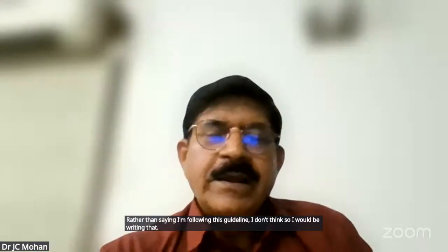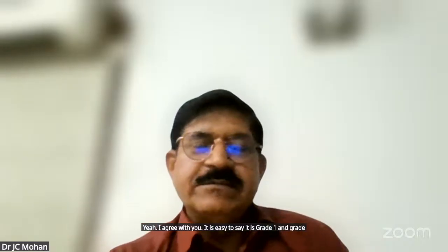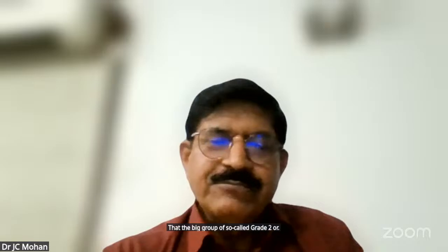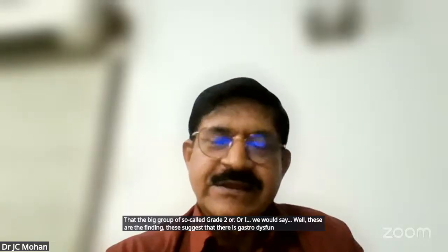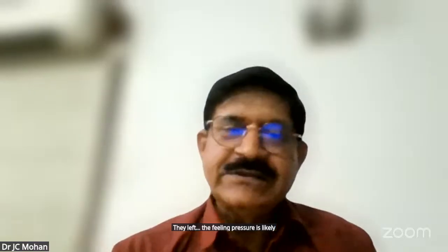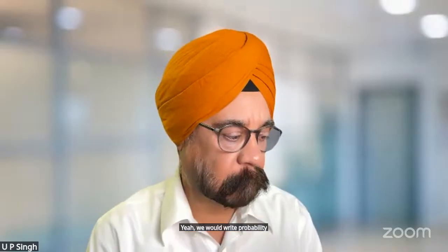Yeah, I agree with you. It is easy to say it is grade 1 or grade 3, but for the big group of so-called grade 2 we would say, well, these are the findings. These suggest that there is diastolic dysfunction present, and the filling pressure is likely to be elevated. That is what I would write. Yeah, we would write probability only.